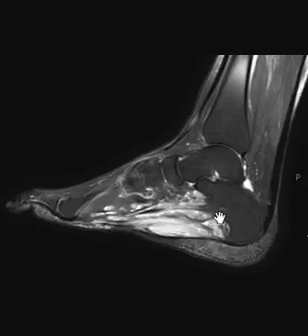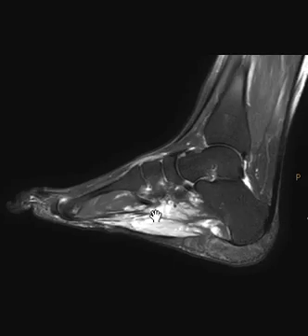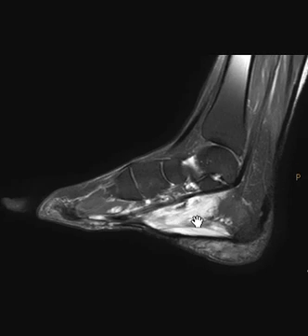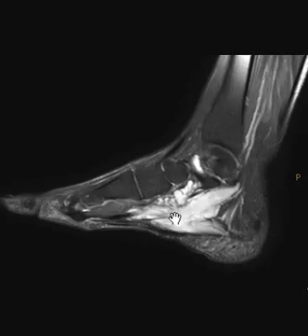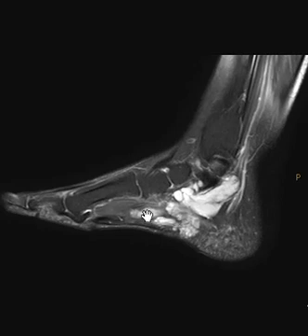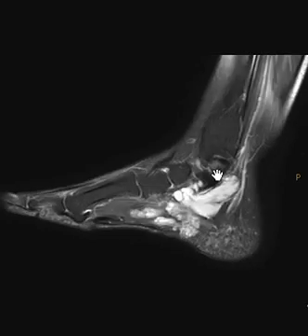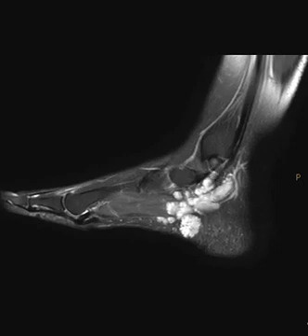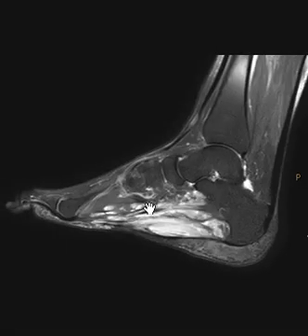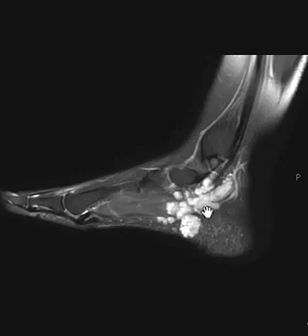It's similar in signal to the muscles, and this is what we call plantar fibromatosis — a fibroblastic process that is infiltrative and sometimes very extensive like this. It is usually in the central and medial portions of the fascia. In this case it's very extensive, coming back along the course of the medial tendons.